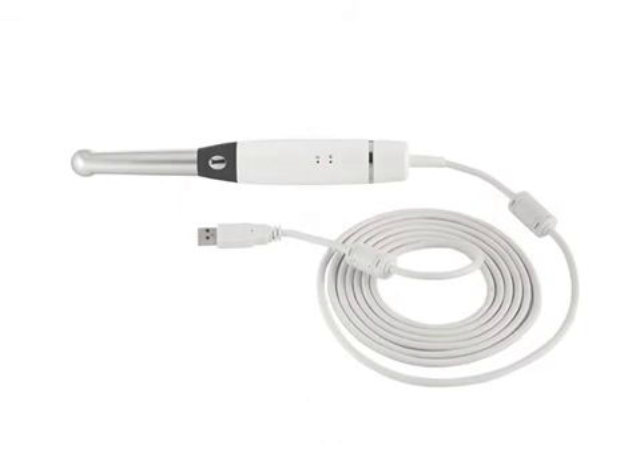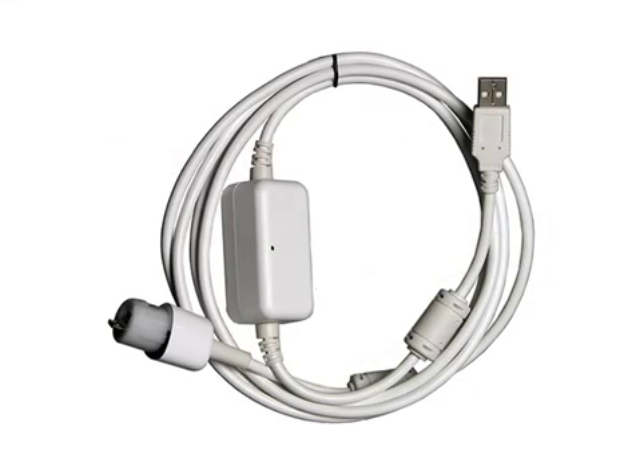Both camera versions ship with a proprietary USB cable. This cable is required to connect the camera to a workstation, or when pairing a wireless camera to a dock station. The USB camera ships with a rapid USB cable. A battery in the cable helps to reduce startup times and permits moving the camera from workstation to workstation without the need to turn the camera off.